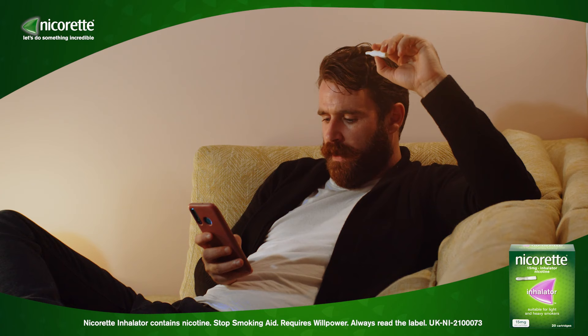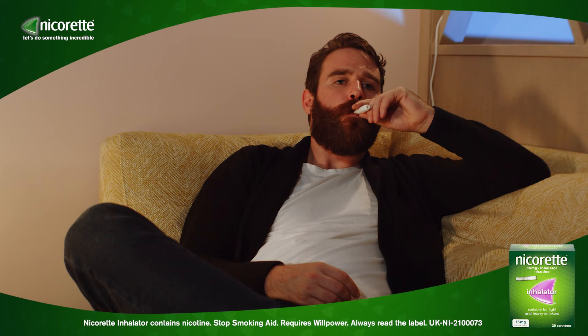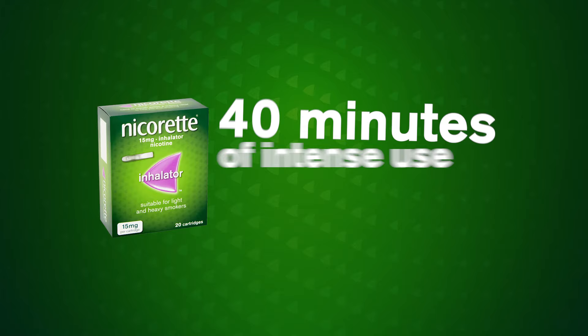It is up to you how many inhalations — puffs — you take, how often you take them, and for how long. Each cartridge provides about 40 minutes of intense use. You can divide this time how you like; for example, you could use a cartridge for four 10-minute inhalation periods.